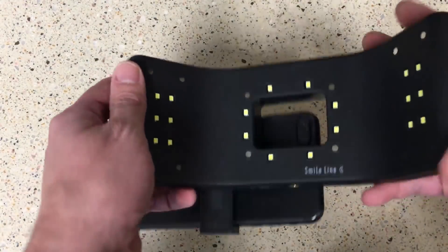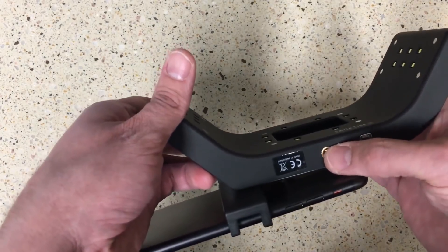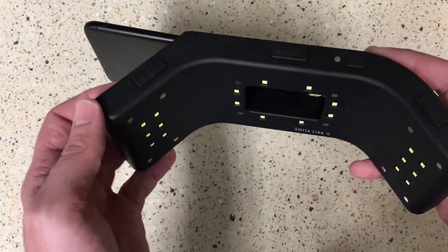This device charges via micro USB and it can also be mounted on a tripod if you'd like. It's a really nice solution to quickly and easily capture color-corrected shade photos for your laboratory.